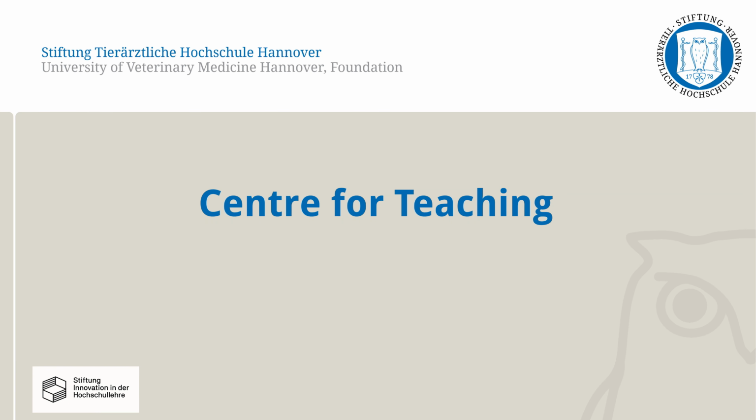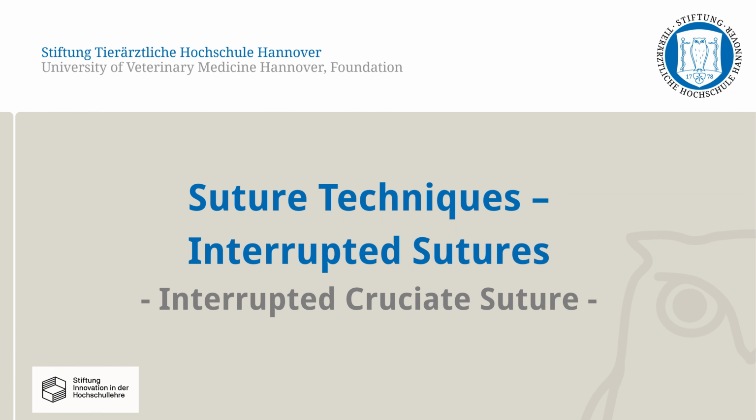In this video, the Center for Teaching at the University of Veterinary Medicine Hannover will demonstrate the placement of a cruciate stitch in the form of an interrupted suture. The focus of this video will be on the technique of the suture.